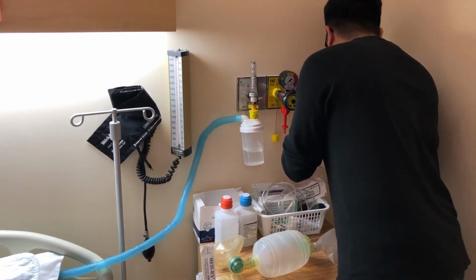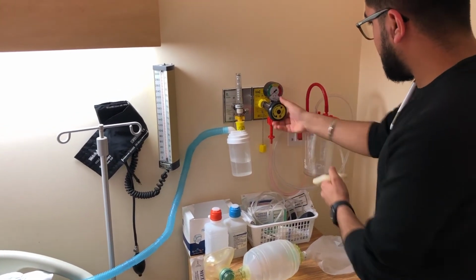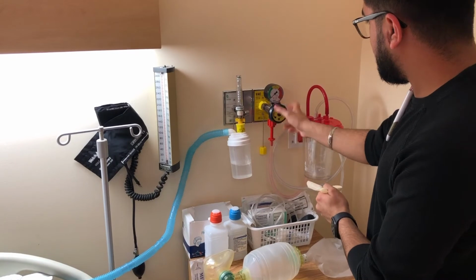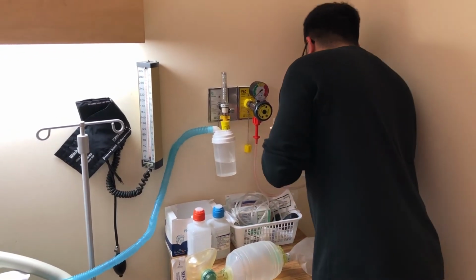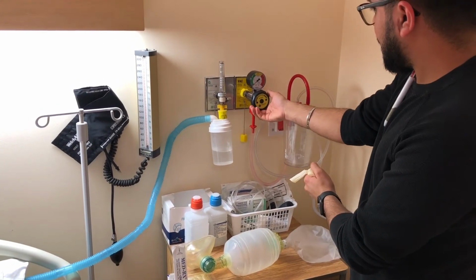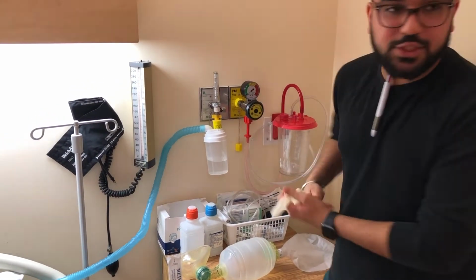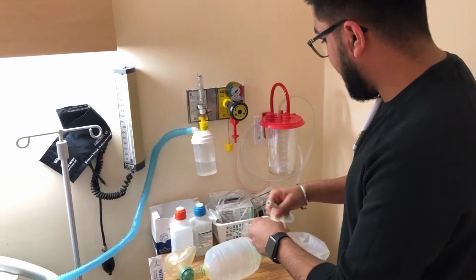Making sure it's clamped. I'll demonstrate that right away. Do you want to come to the side? I'm just going to show you the side. So the suction should be working, and we can verify that it is.